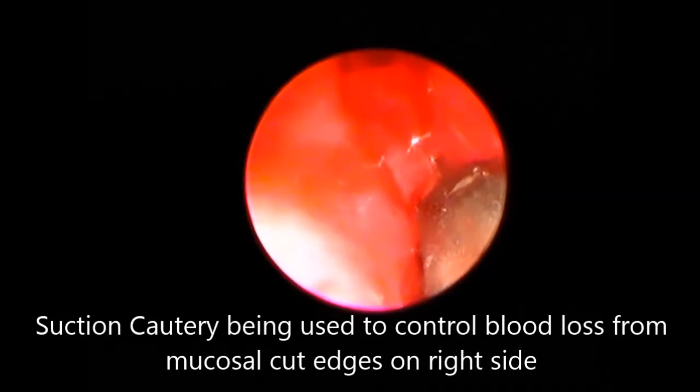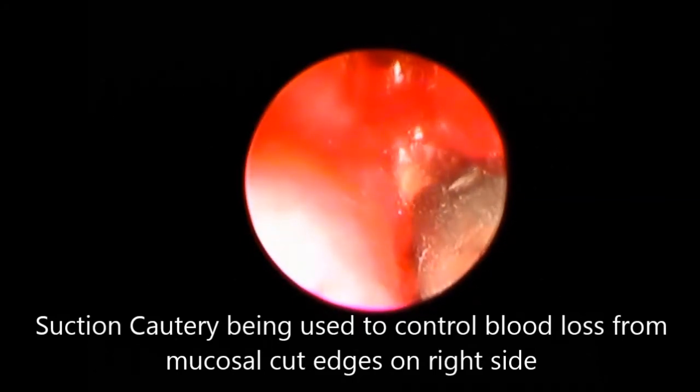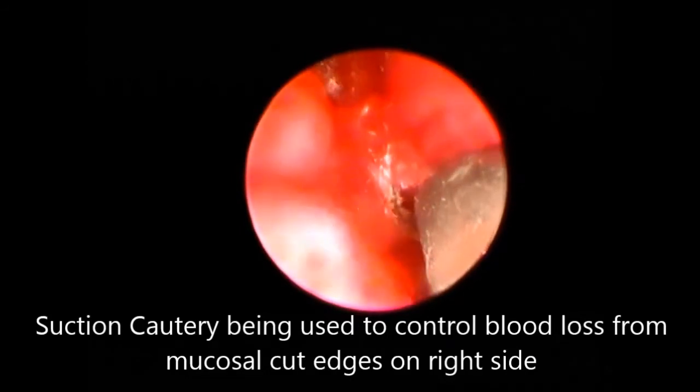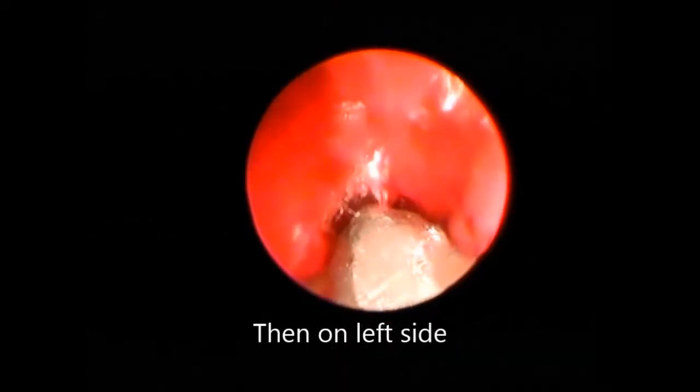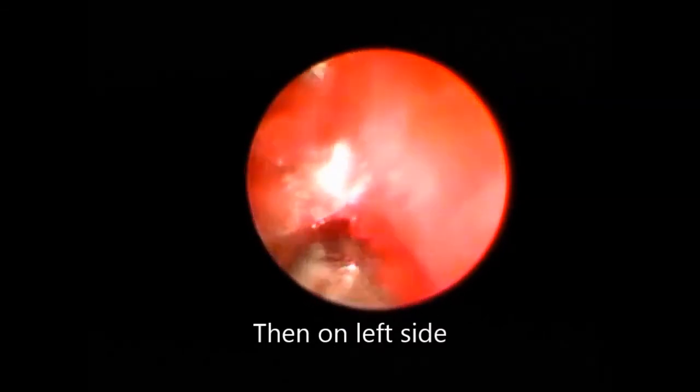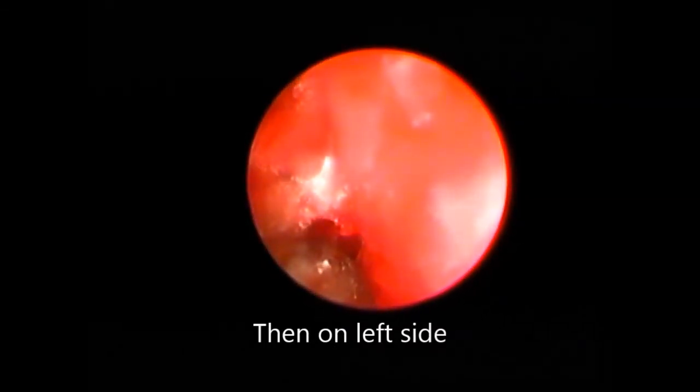The mucosal cut edges were finally cauterized again because we did not plan for any repacking of the nose. The stents were placed on both sides of the nasal cavity. The same procedure was then performed on the left side.